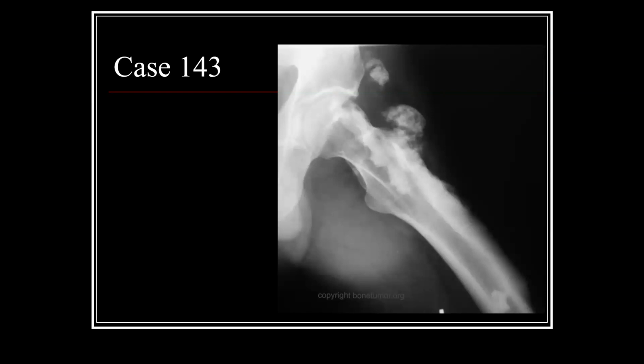Here's another example of an osteoblastic lesion, but this is almost a polypoid type of pattern. And you see there may be multiples of these sorts of lesions. And it looks as though it has some connection to the underlying bone. And here is where we see some of the challenges with plain films, because we can't localize whether this density here is inside the bone or opposite on the back side of the bone as a related entity to this. So it's difficult to know if this is an intramedullary component or otherwise.